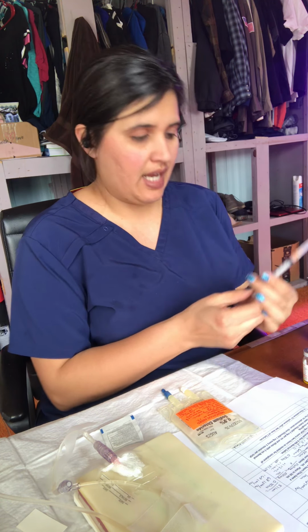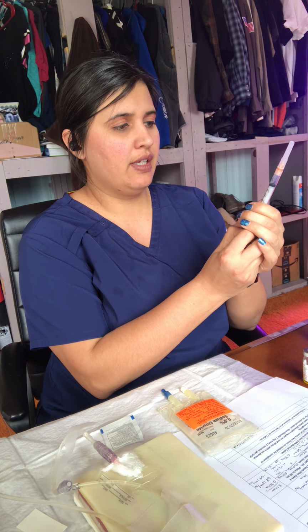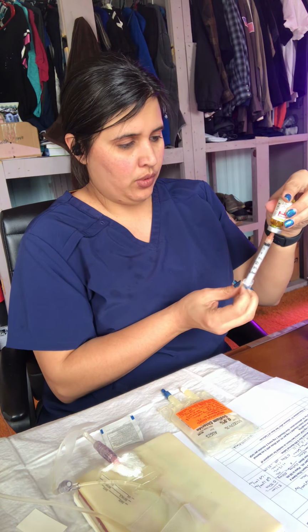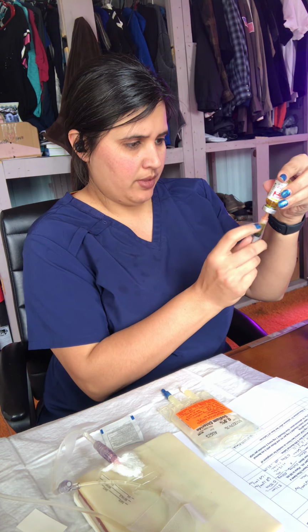Since I need to pull out 1.1 milliliters, I am going to pull 1.1 milliliters of air. So that's to here. Yep, that's to there, 1.1 milliliters. I am going to insert, add air, and then pull 1.1 milliliters of medication. Get rid of any of the bubbles.